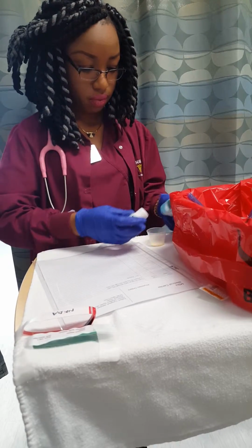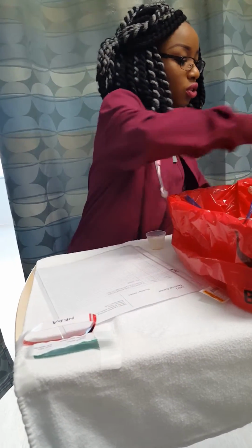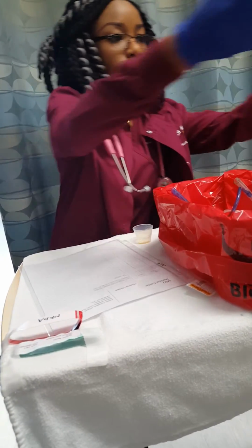Okay. Put in my medication. So I'm just going to put a little bit of normal saline with it.